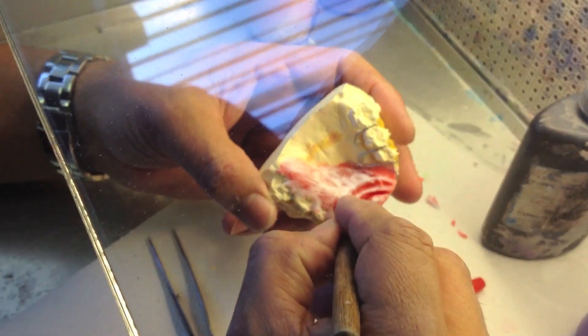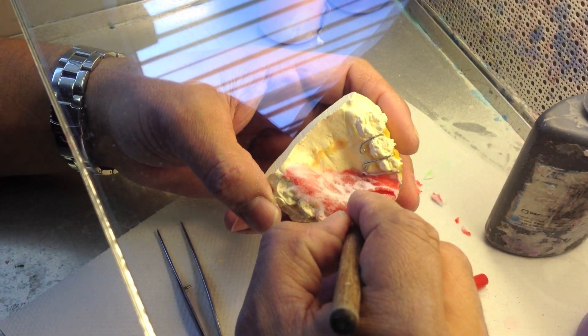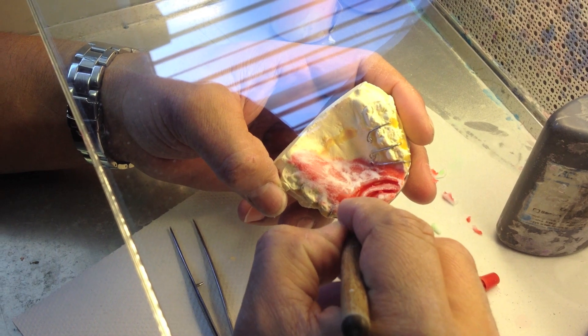He makes the top surface as dry as possible so that it will be able to carve like this and the walls won't slip in on you.